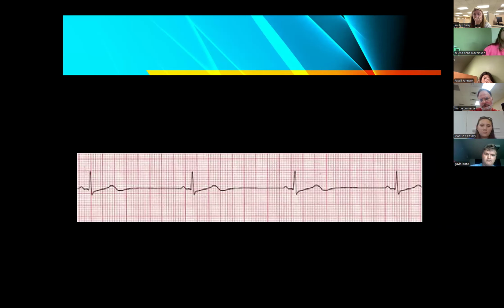Oh, hold on. Jasmine, does the length of the QRS matter? Great question. I will tell you the length or the width of the QRS, we can call it either one of them. But if it gets beyond 0.12 seconds, that's an indicator that that QRS is actually originating in the ventricle. So we have some malfunction. Oh, the height. Yes, it does. But for this class, we don't worry about it.